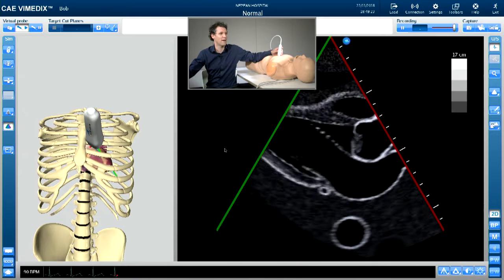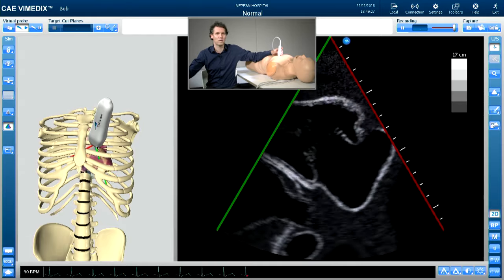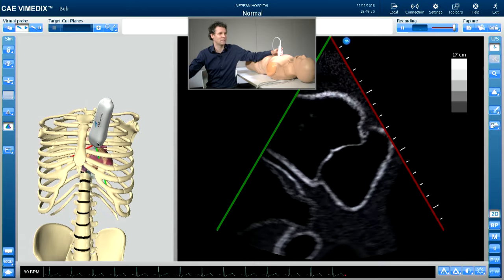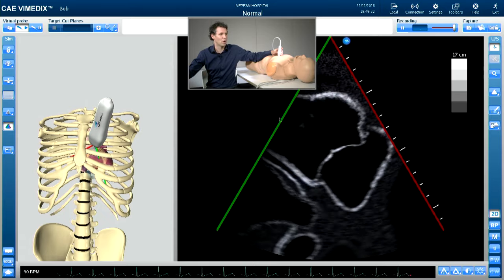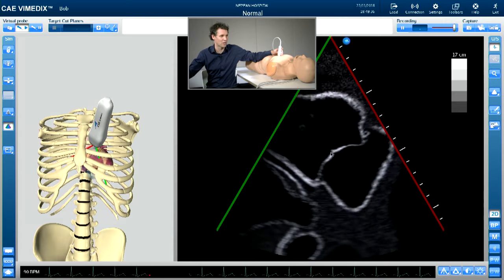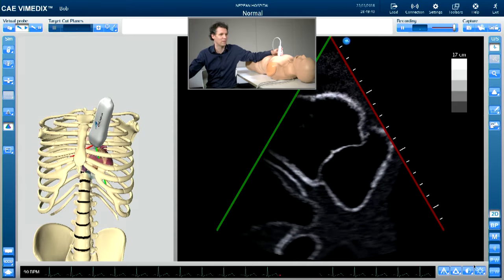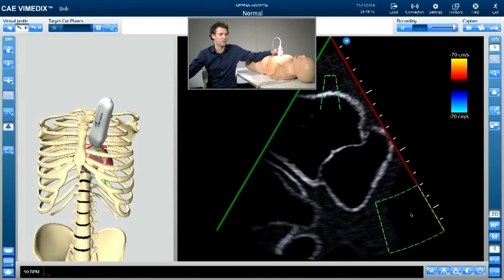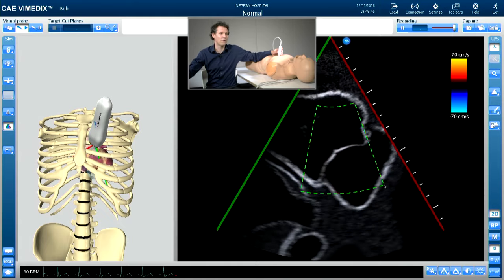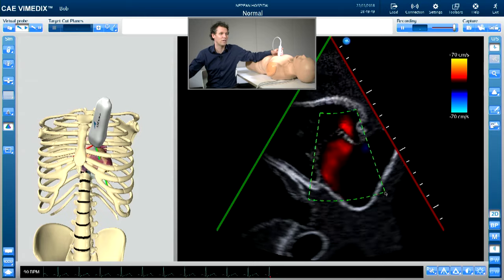We can then fan down by tilting our probe, pointing it down more towards the patient's right hip. Here we can see the RV inflow view, where you've got the tricuspid valve in the middle, the right ventricle at the top, and the right atrium underneath. Again with the color box, you can put it over the tricuspid valve to get an idea if you've got any regurgitation flow.